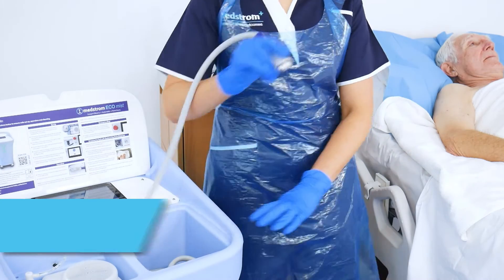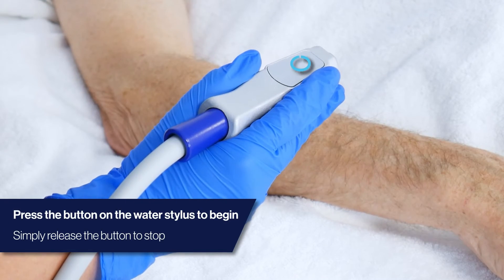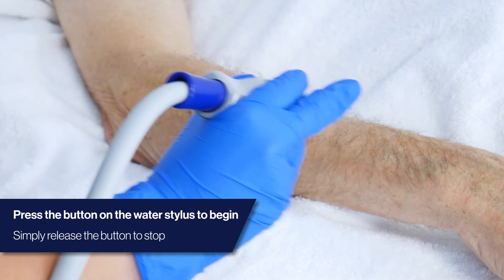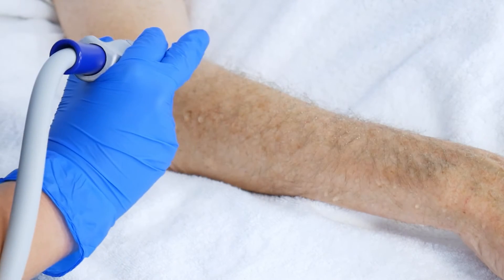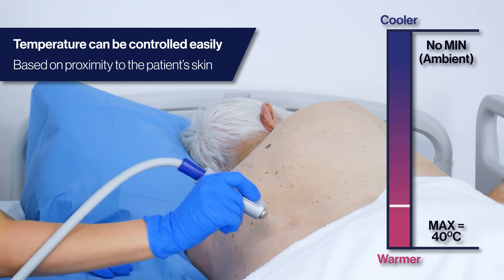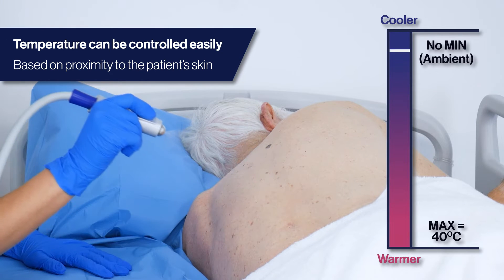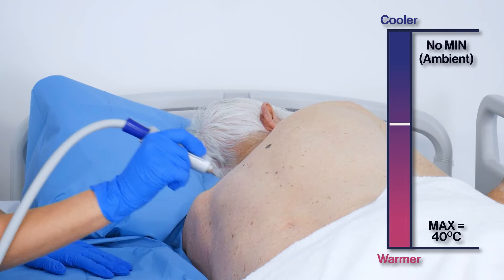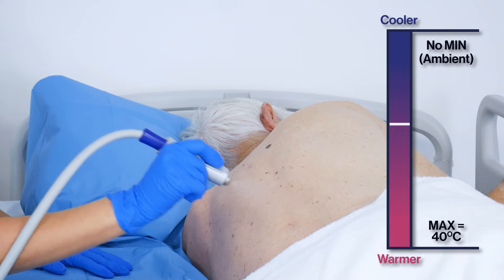When you are ready to spray the water, press the button on the water stylus. To stop the spray at any point, stop pressing the button. Please note: to control the temperature of the EcoMist, users can adjust how close they are to the skin. For example, the closer the water stylus is to the skin, the warmer the water.